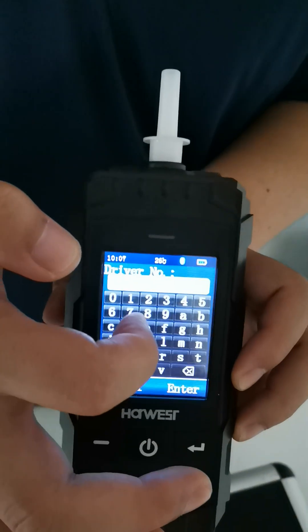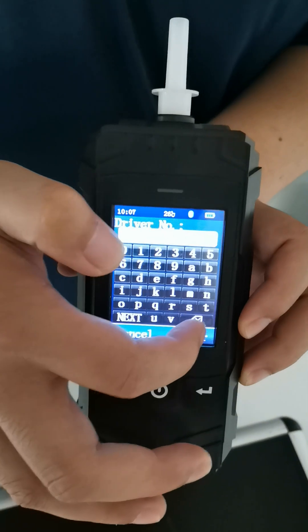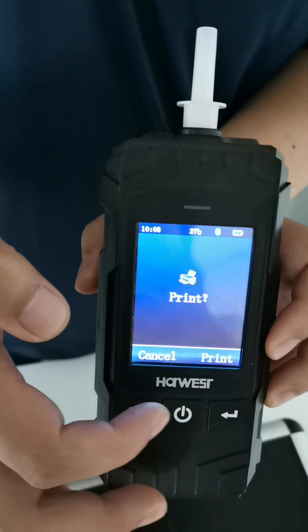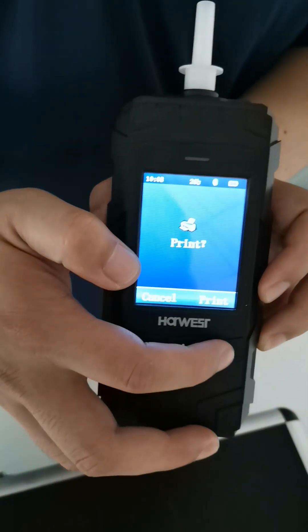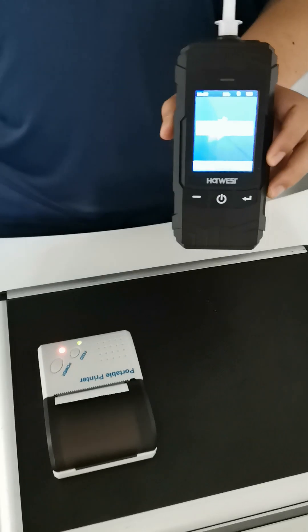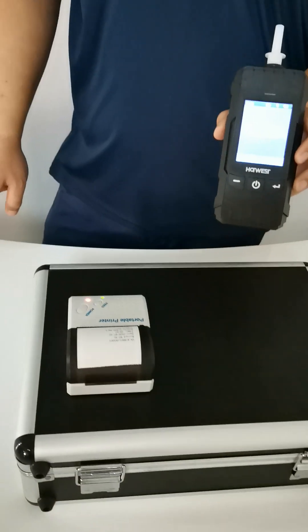You need to input the driver name, the driver number, and the car plate number. Then press print. You can see the result has been printed.